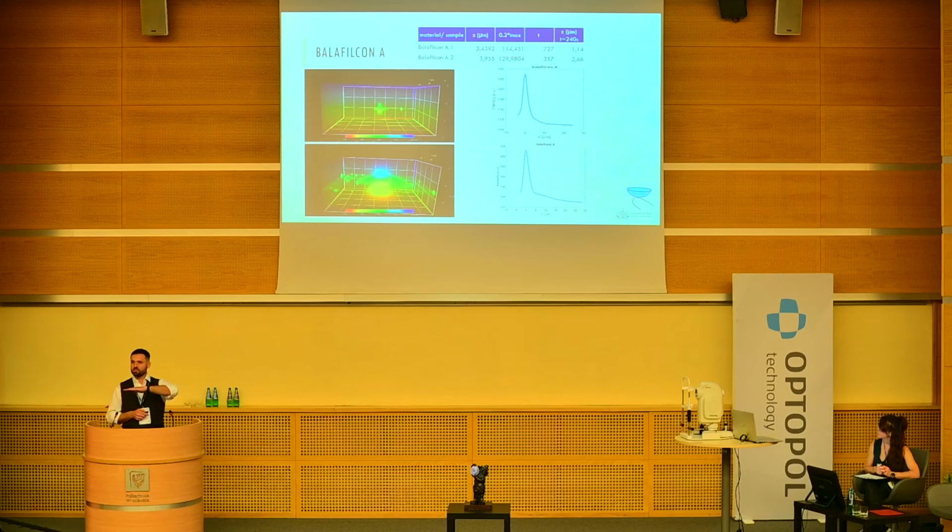This is the place where we have the biggest intensity of the fluorescently tagged cholesterol, and then we are looking where the intensity of the fluorescent light is 0.2 of the maximum, and this place is called Z. So let's call it the depth inside of the lens.